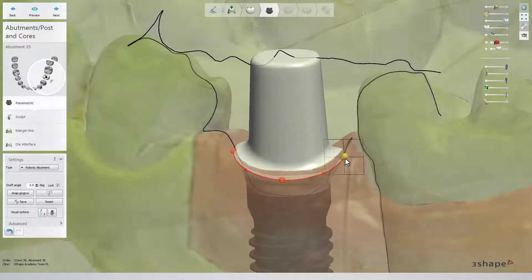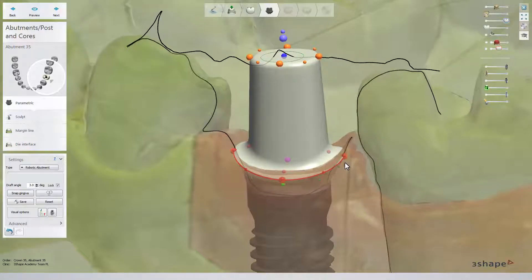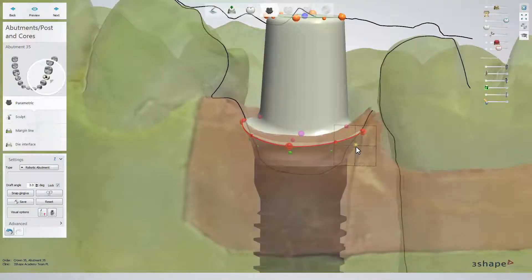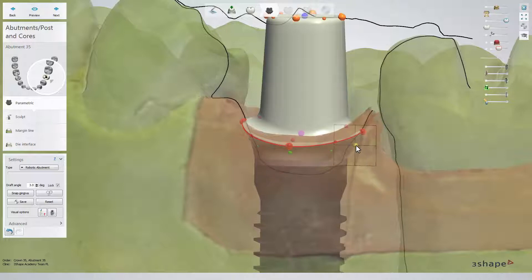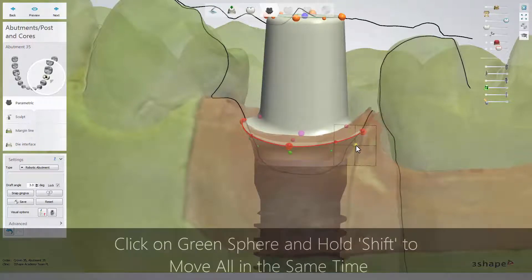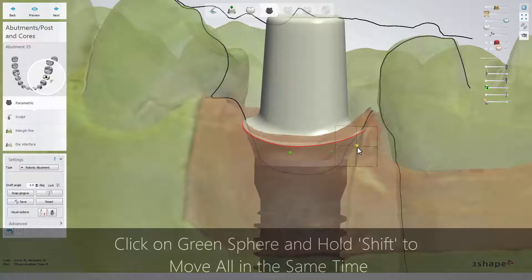With the robotic abutment, there are also green dots subgingivally. This helps you to shape the emergence profile. These dots are activated when you point at them with the mouse cursor. The grid is also available.